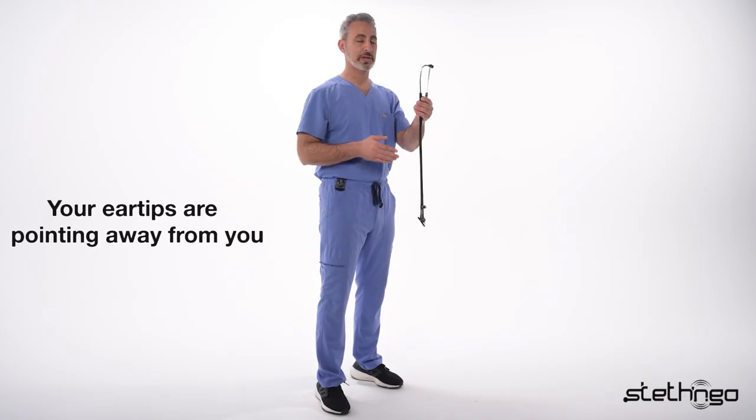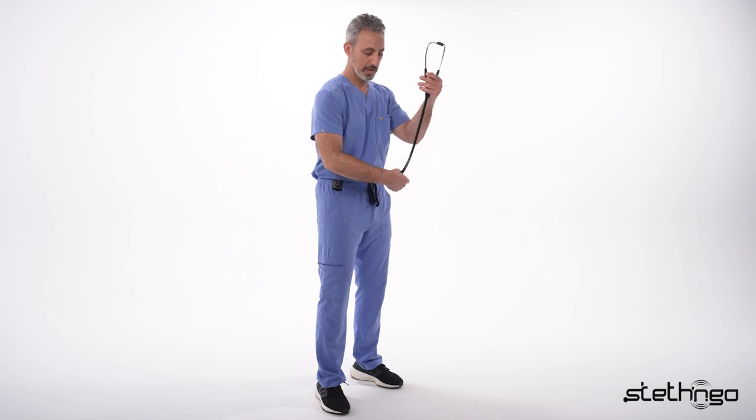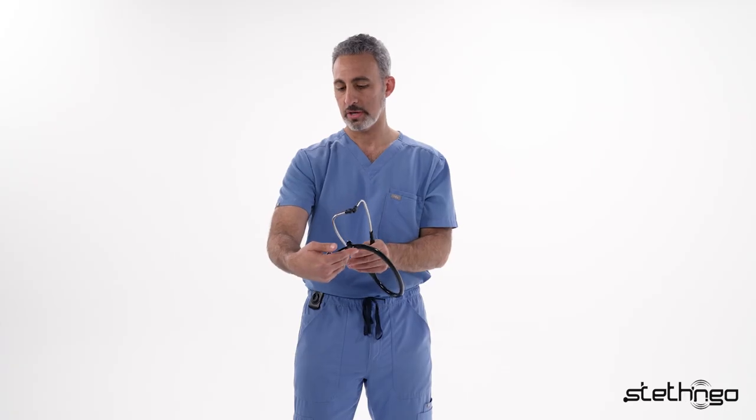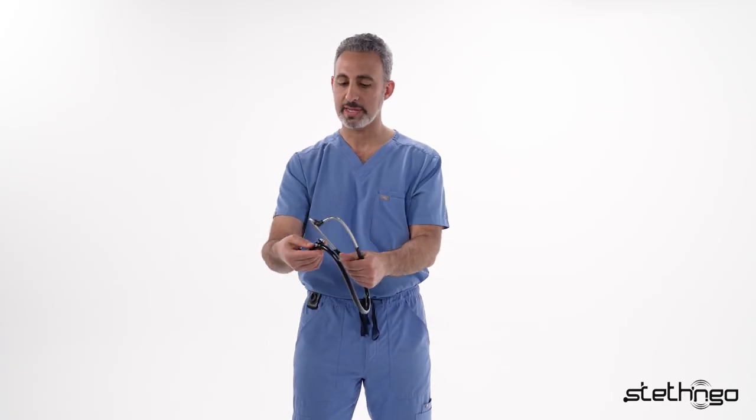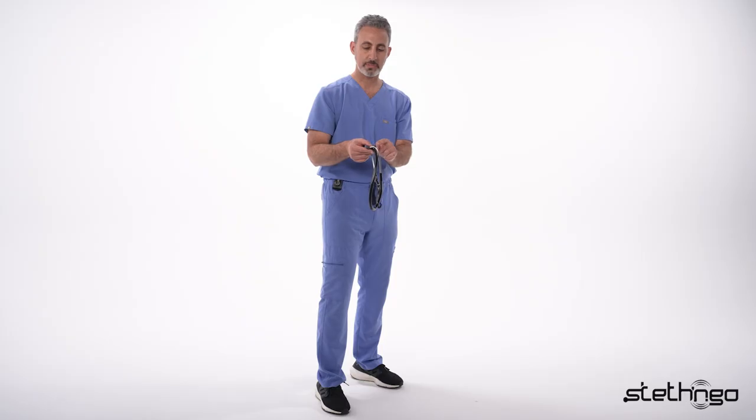After examining your patient, your ear tips are pointing away from you. You're going to take the diaphragm with your right hand. You want to make sure the diaphragm is veering to the right. You're going to take the steel piece right underneath the ear tips. Make sure that the ear tube clip area is facing upward.